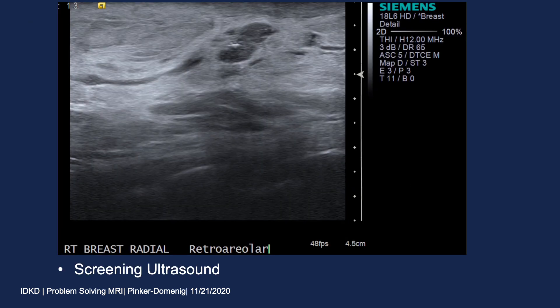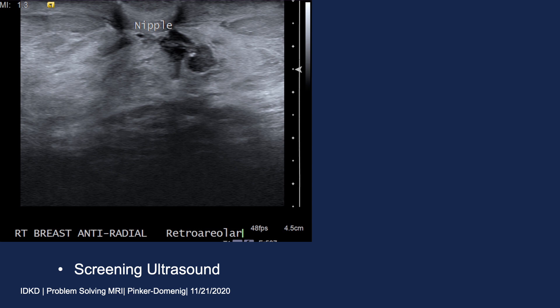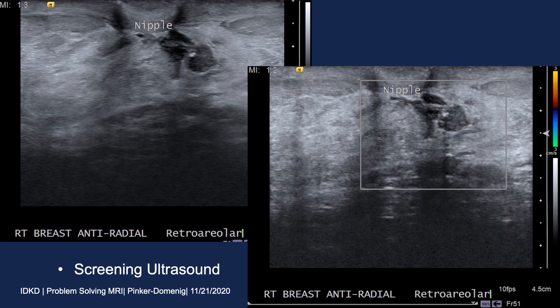On sonography, immediately retroareolar, she had hypoechoic tubular structures. In relation to the nipple, there were more anechoic areas felt to be ducts with secretions, which led us to think the hypoechoic material with a tubular shape could be impacted debris in a duct rather than a solid component. To confirm this suspicion, we performed color Doppler and no vascularity was detected within those hypoechoic masses.